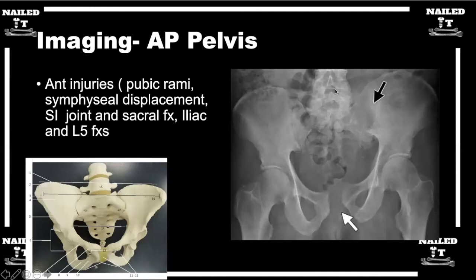And if you continue to draw markers — whether from the top of the ilium to the top of the ilium, the sourcil of the dome of the acetabulum to the contralateral dome of the acetabulum, or the ischium — whatever markers of symmetry you want to use: if all of those lines are at the same level, symmetry is maintained. If they're at different levels, symmetry is disrupted. If they're all uniformly displaced cranially, it's vertically unstable. But if the ilium are at the same level while the ischium or sourcils are at different levels, that's usually a sagittal plane rotational deformity as opposed to true vertical instability.